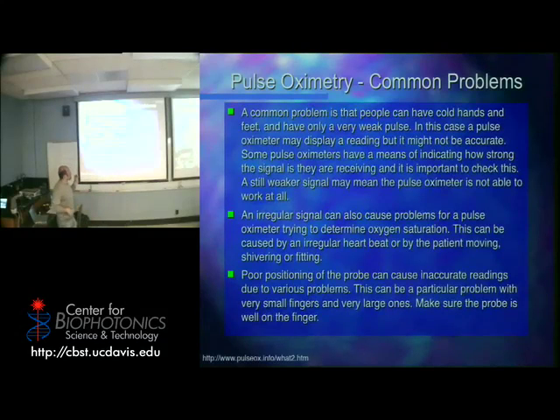But anyway, it is really important for all of these devices to be considered accurate, for them to be able to say if the signal is strong enough. So on the one that's passing around, there's a little indicator that goes up and down that it has to monitor to see if there's enough signal. So what are some possibilities where you might not get enough signal?